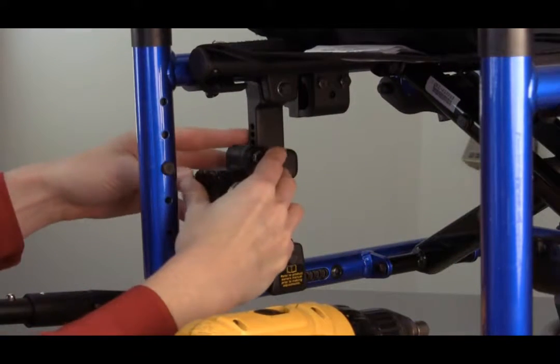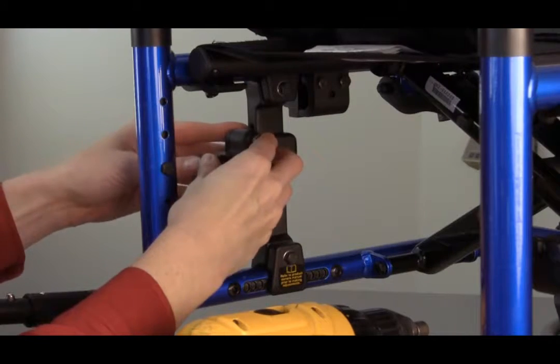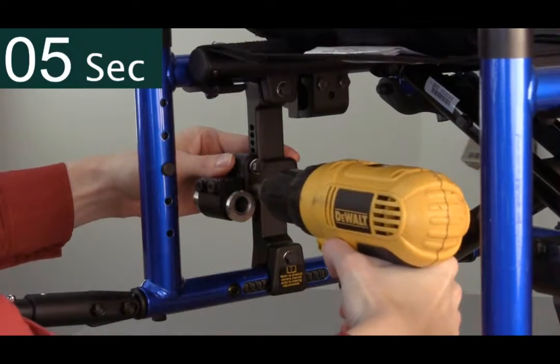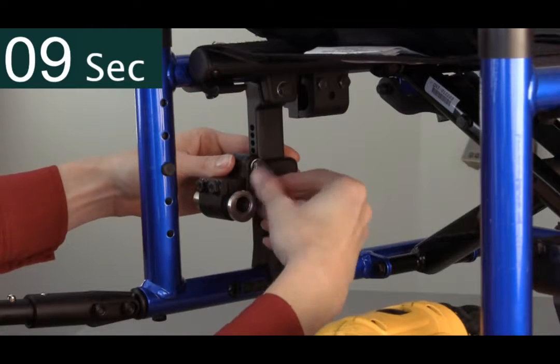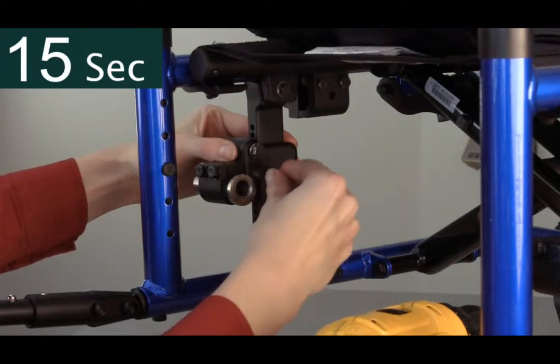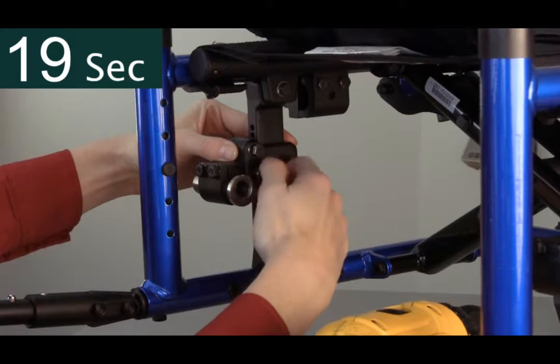Sometimes, during the final fitting, it becomes necessary to also adjust the rear seat-to-floor height. Again, using the same 10 mm tool, simply loosen the top bolt and remove the bottom bolt. In a ratcheting style, move the plate up or down to the desired height. Once this is achieved, hand re-tighten the top bolt and insert the bottom bolt.